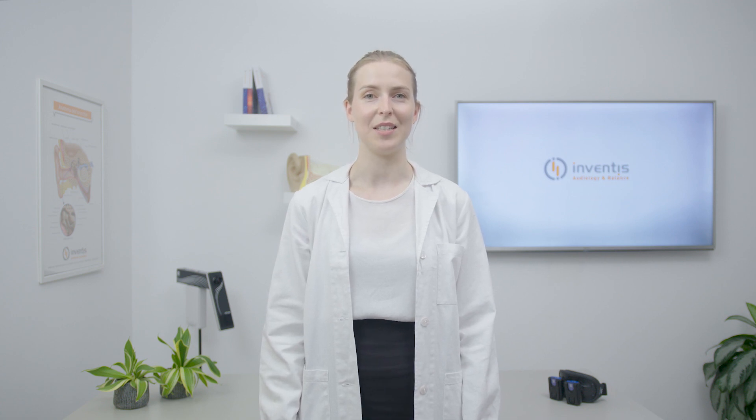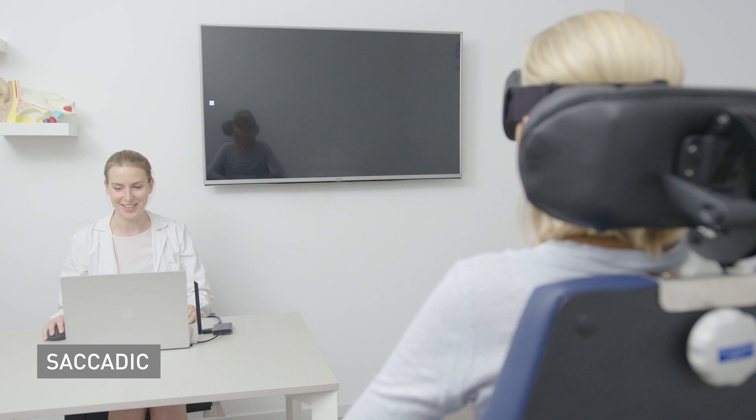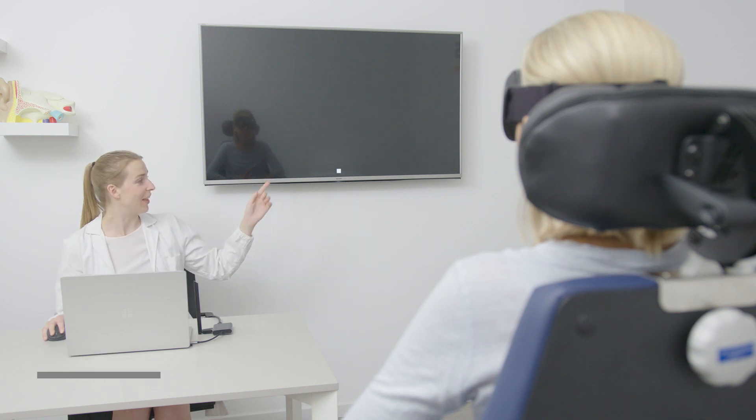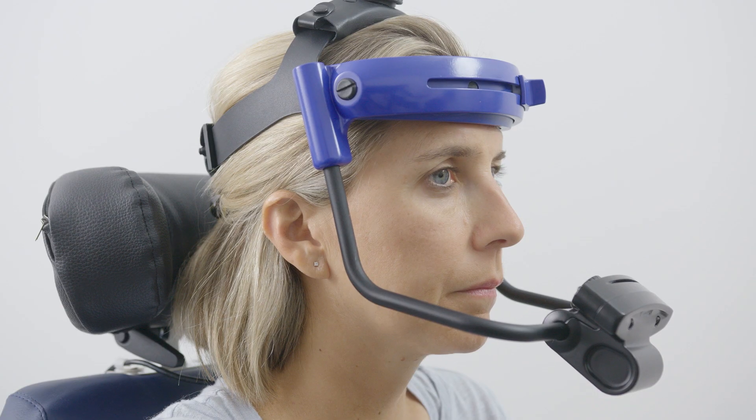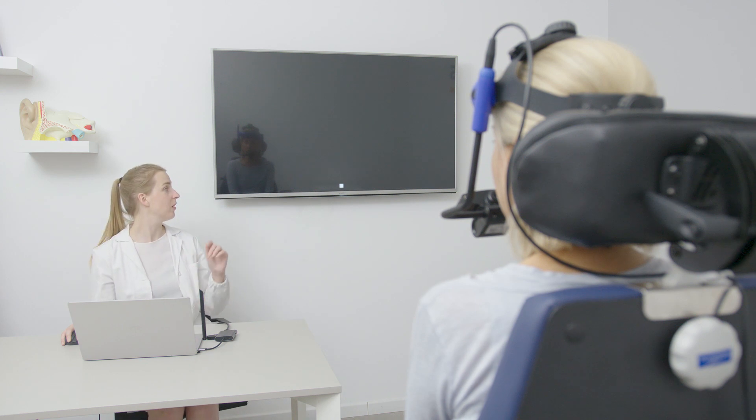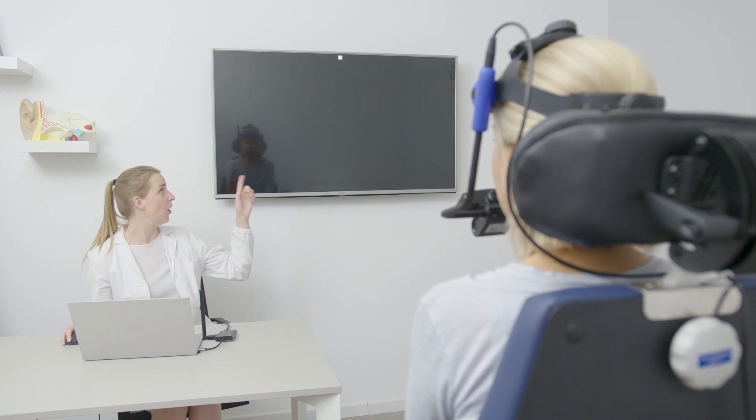As part of saccadic testing a wide range of examinations is available offering the flexibility to customize frequencies, directions and amplitudes in fixed or random modes.